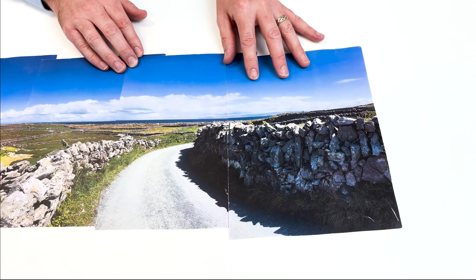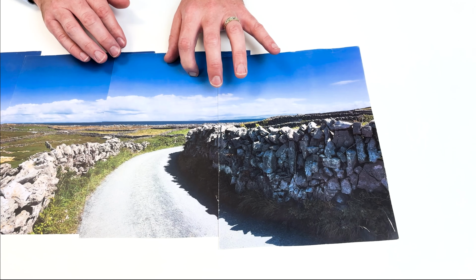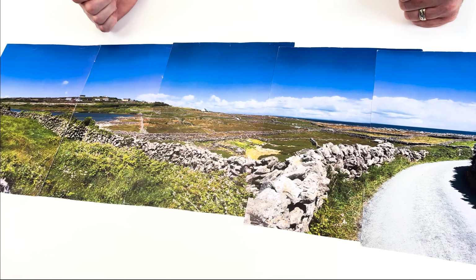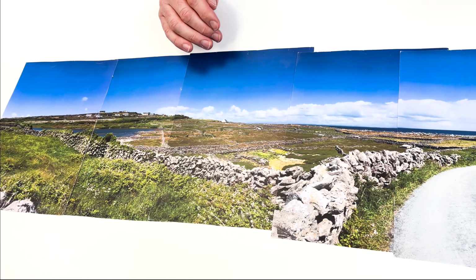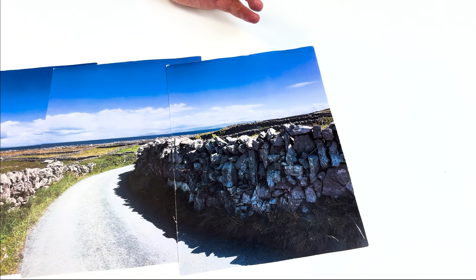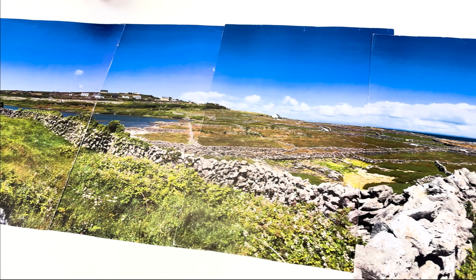Or we might have other situations that are challenging in terms of details that are moving. So we've got mobile tissue, maybe we've got some teeth that are loose, and that makes things a bit more challenging as well. But I took these photographs many years ago in a particular sequence at the same time. The cloud pattern is the same. We don't have cars moving to upset our images or anything like that. So we've got a really good panoramic picture of 6 individual shots, and we've lined them up. It's probably taken me about a minute to do it.